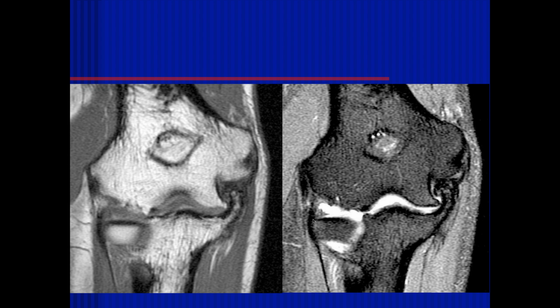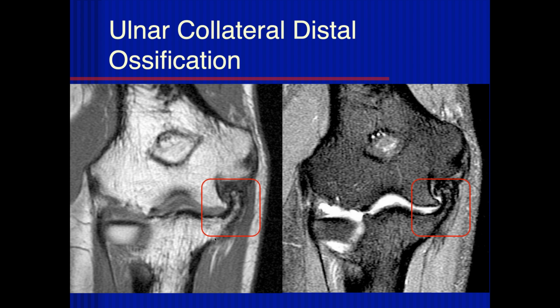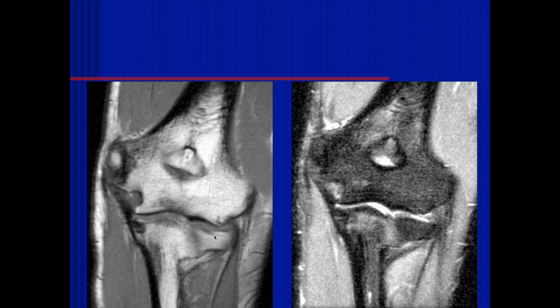Along where the sublime tubercle is, we have this extending ossification. It's pretty significant ossification of that ligament. Again, chronic disease. This is another chronic athlete who got hypertrophic disease, and this is just the most extreme example that I've seen. Jennifer, what do you think of this?